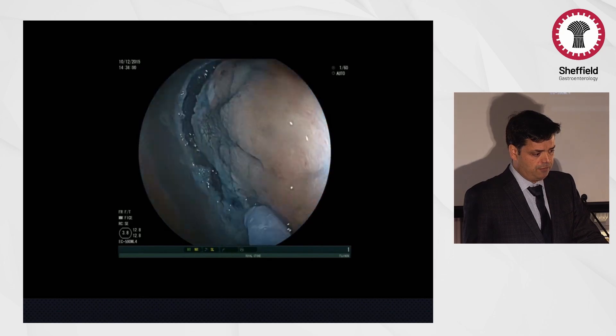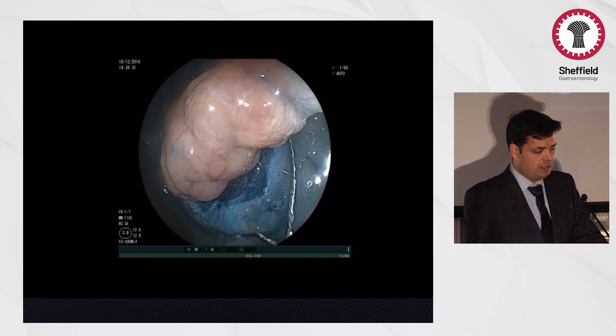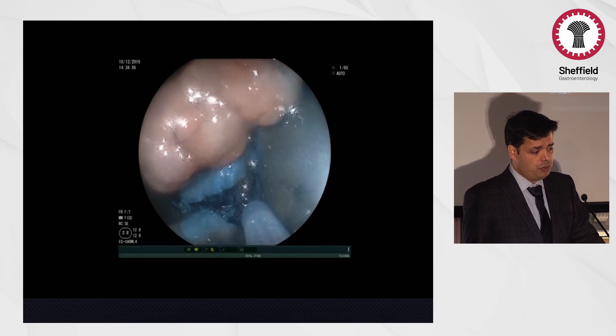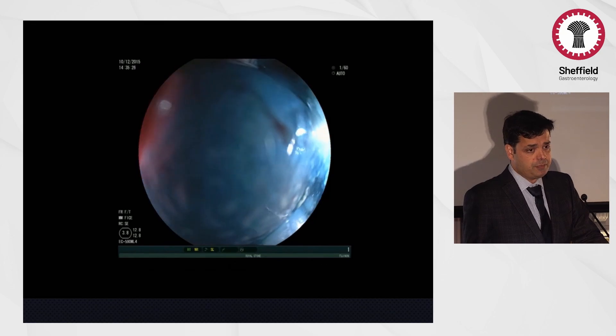Just completing the circumferential incision now — engaging the snare and catching it in the groove. Now you're creating a pseudopedicle, and then dissecting the lesion at a deeper submucosal level.